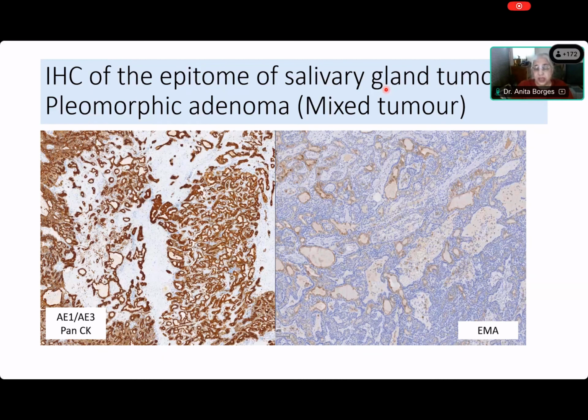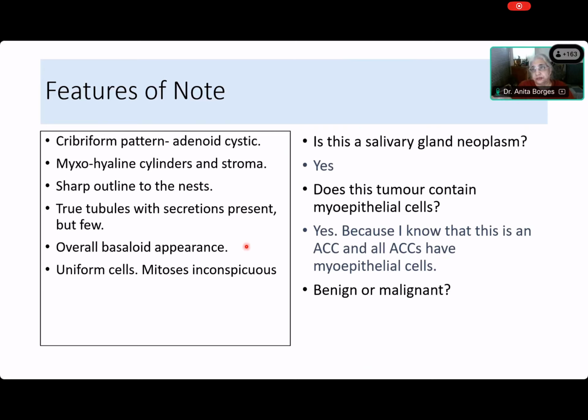Come on, Somik, what's your confusion? Because if you have confusion, others have confusion, and I want to get this straight. Madam, because mitosis was inconspicuous and there was no necrosis, I can see in this slide. So I knew that this is the problem. There are no mitoses, they're uniform cells, they all look monomorphic, and that's why.